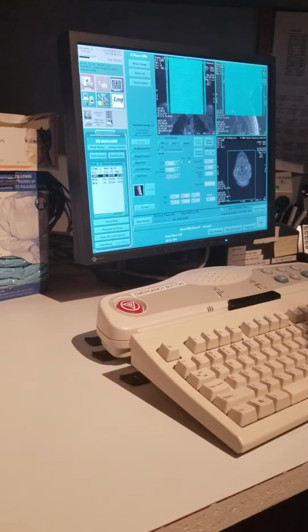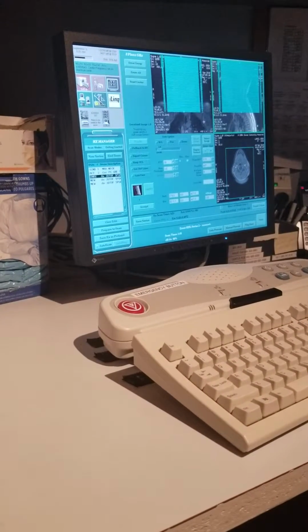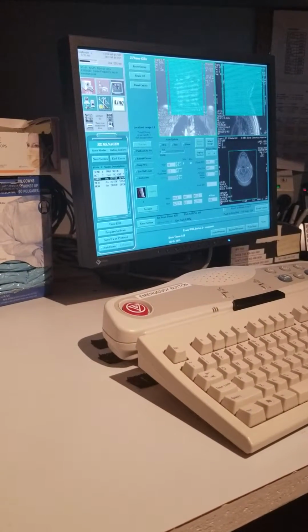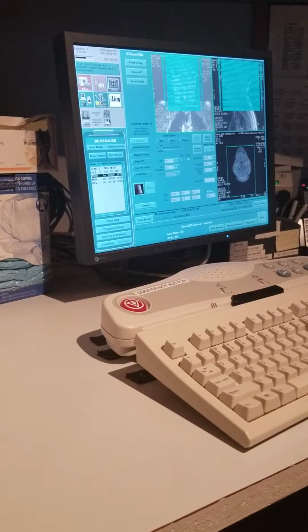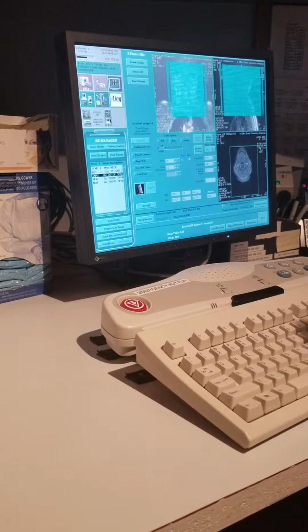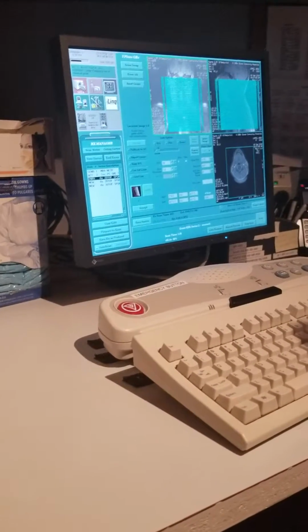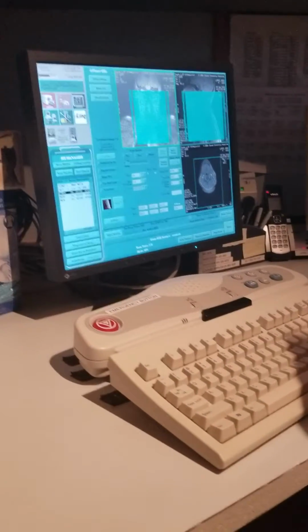So we'll include the arch, even though we won't see it on the scan because it's just too much turbulent flow for the 2D, and it's multi-directional. Whereas coming straight up, we're able to image it without the artifacts. When it's turbulent and going all different ways in the arch, we're going to have artifacts. So we want to go into the arch of the heart. Keep going down. There you go. See how you're right to the base of the skull? That's good. We won't see anything here unless we give contrast.